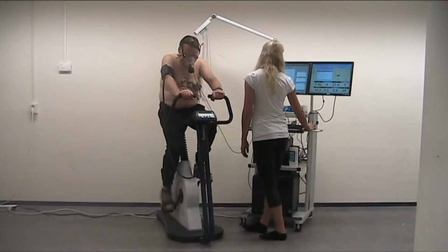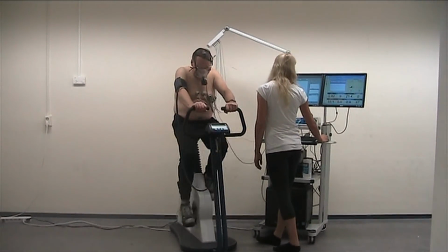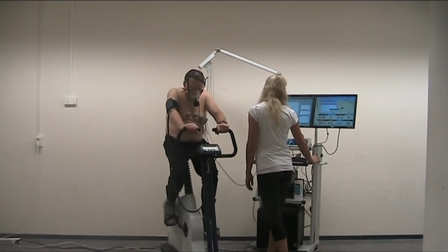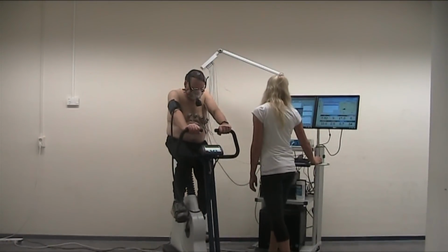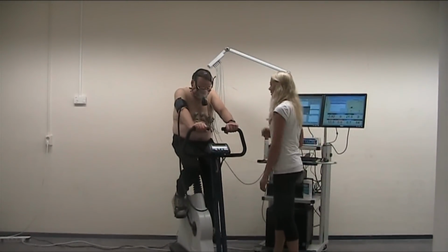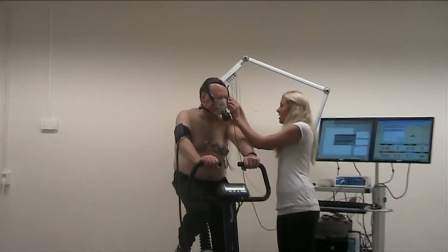However, in this phase, it's normal to see that the body is hyperventilating, which still raises the RER and the CO2 values. After 2 minutes, this should be gone, and all values should decrease to resting level. After this, the test is finished and the equipment will be taken off.